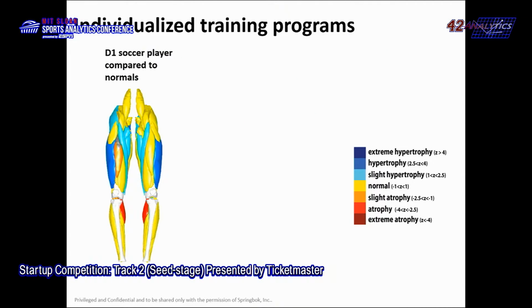So here's a soccer player. This soccer player has injured one of his quad muscles. And you can see that quad muscle is in orange. And then you can see a little bit of scar in the quad muscle. And then you can see that some of the other muscles in the upper leg are blue, and so they're strong. This is all in comparison to normal volunteers, not to elite athletes.